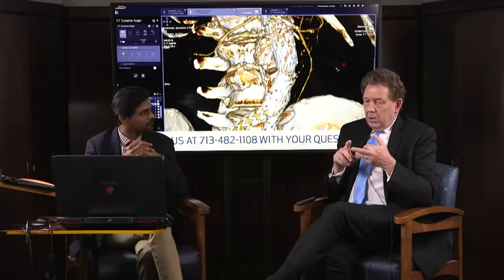So in terms of what to do about this, we kind of covered a few of the approaches to start with. To my mind, looking at this, is there an arterial access, for example, an ascending lumbar? These can be difficult. Is there an IMA that we can get from the SMA? Failing that, then it's either translumbar, transcaval, or we can go transgraft, perigraft or transgraft.